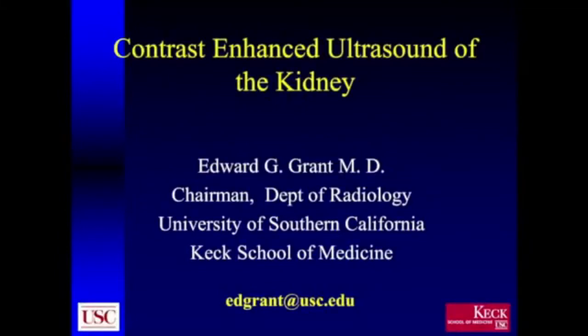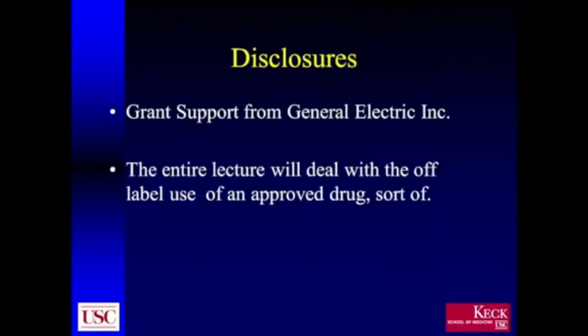Okay, this is Dr. Ed Grant. I'm the chairman of the Department of Radiology at the University of Southern California. And I'm going to be speaking for the next hour or so about contrast enhanced ultrasound of the kidney.